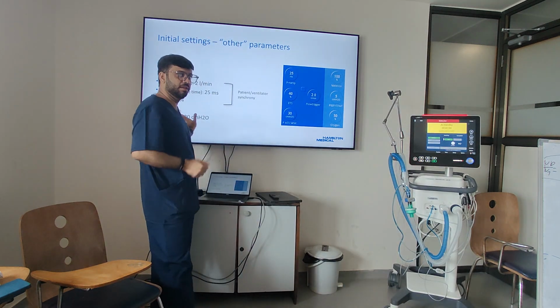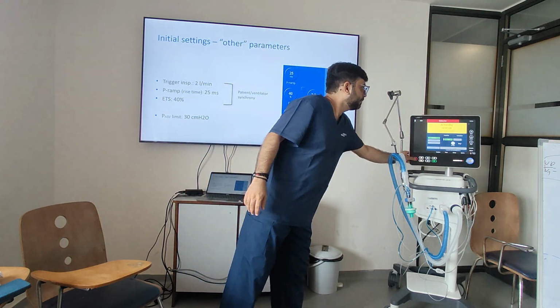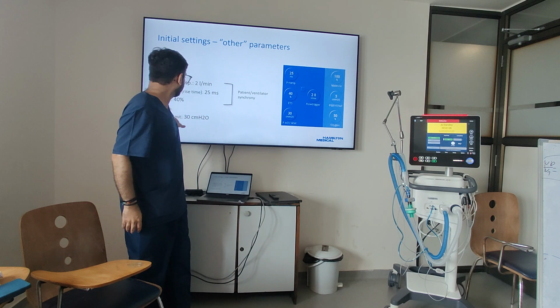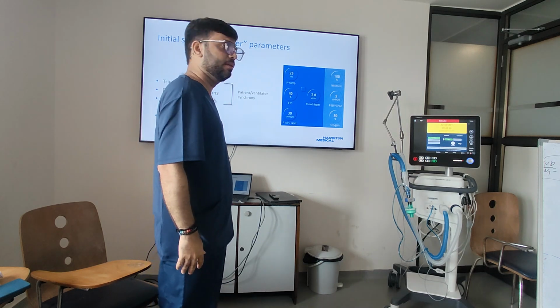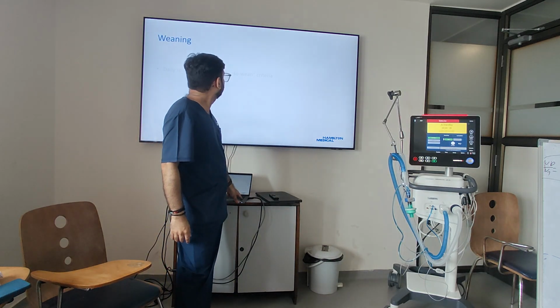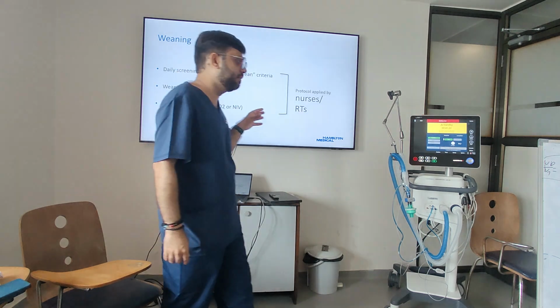And the ASV limit, again the default set is 30. And it is low. So in this particular part, your ASV limit is set as 30. But if you have ARDS and other things, you can titrate your ASV limits to how much ever you want to achieve.